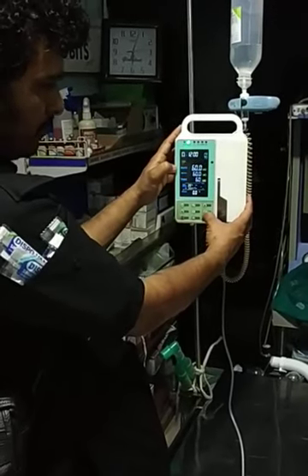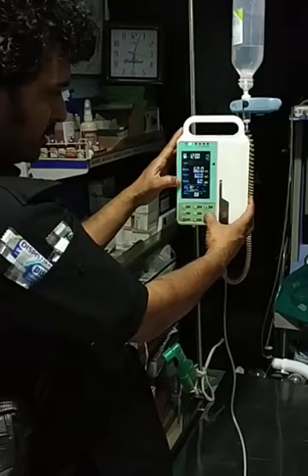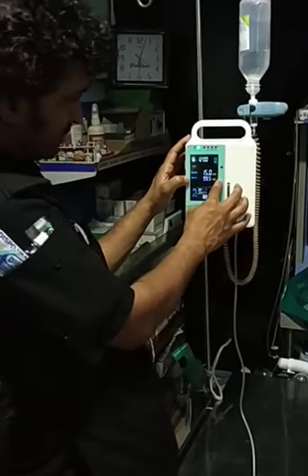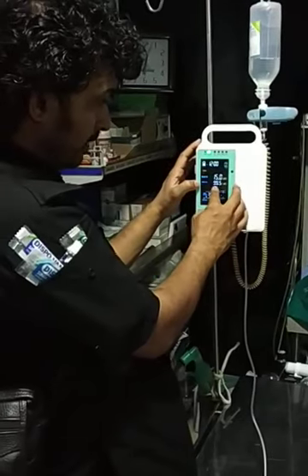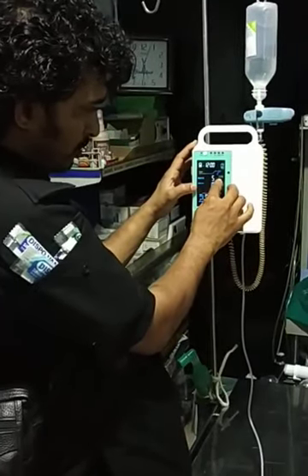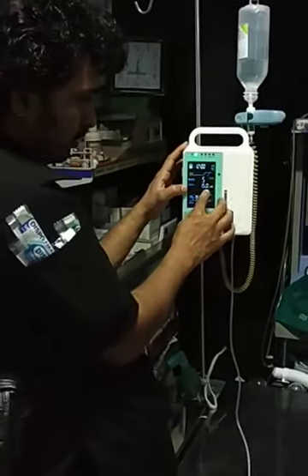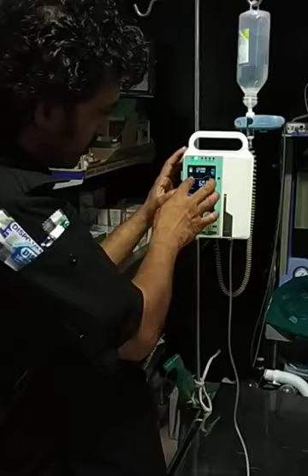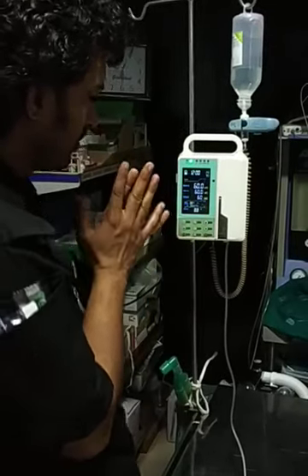Rate is in ml per hour, target volume is in ml, and time is in minutes. Alternatively, I can have the rate and target volume in two different settings. There is another option where drops per minute can be set, but for ease it is very easy for us to use the rate, target volume, and time combination.